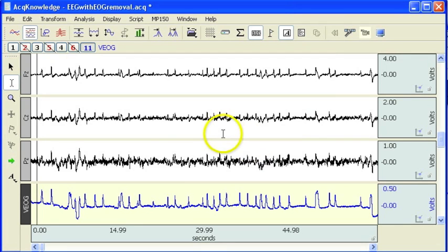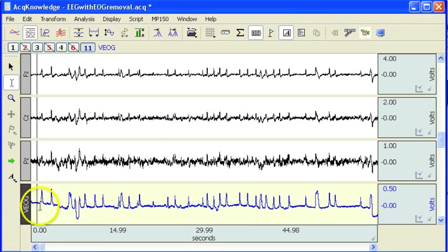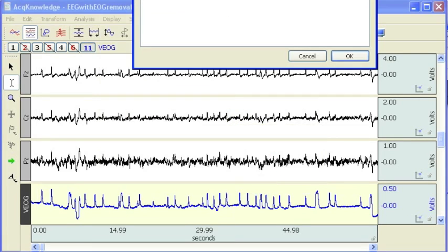In order for this particular analysis to work, you do need to record an EOG channel. In this case it's the vertical EOG, and you can clearly see the blinks, and they correlate with the artifact that's marked on FZ. So in order to run the analysis, we go into the EEG menu and select Remove EOG Artifacts.